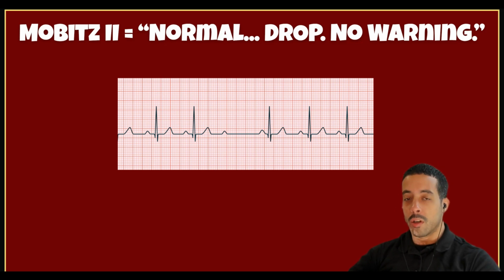And when you give a notification, remember to share the person's age, how you found them, what's going on, or what is your presumptive diagnosis. How you found them goes more in the paperwork, but what's your presumptive diagnosis, their vital signs, your ETA, and let them know that they're being paced actively.